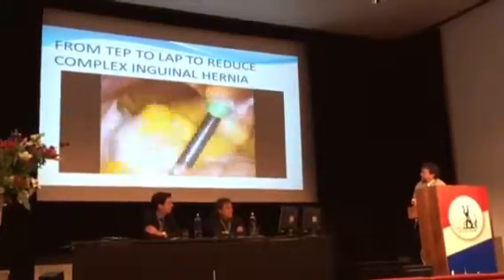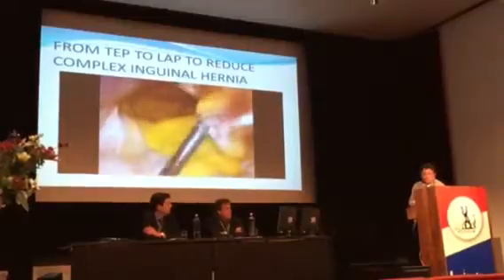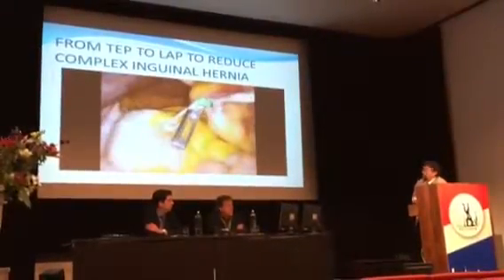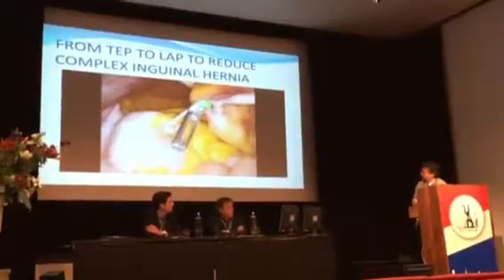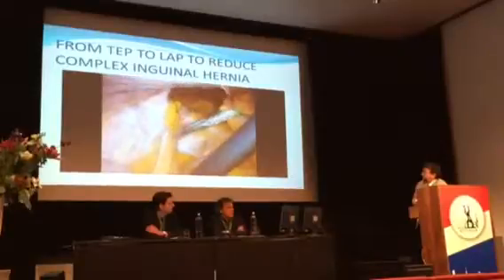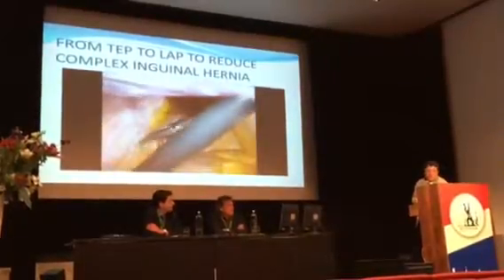So we retrieve the small bowel and now the large bowel, and we can also clear all the attachments of the large bowel to the hernia sac, getting a complete reduction of the hernia contents.